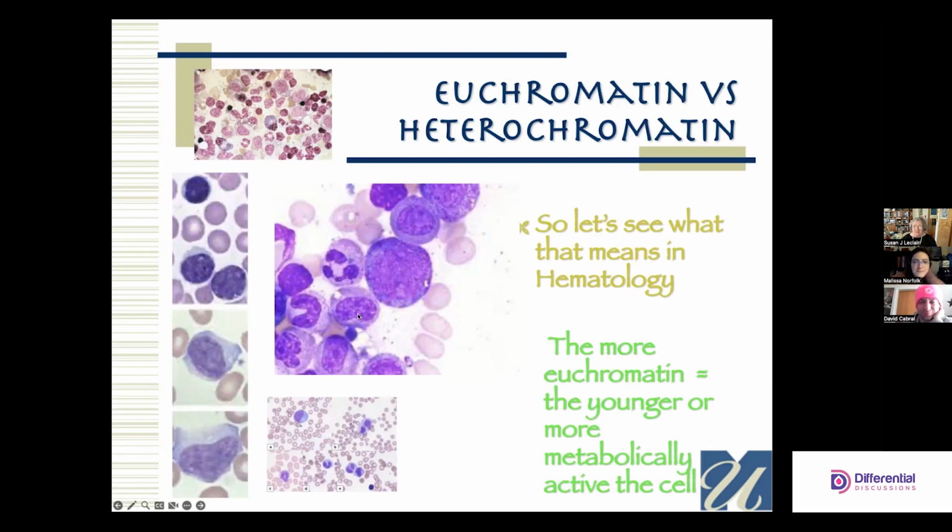Which, when you come to think of it, in this cell, in terms of functionality, it knows it's going to be a granulocyte. It's already undergone a couple of mitotic divisions. It's made all of the primary granules that it's going to make. It's made most of the secondary granules. It needs to do some outside work, you know, motility, phagocytosis, antigen recognition, and stuff like that.